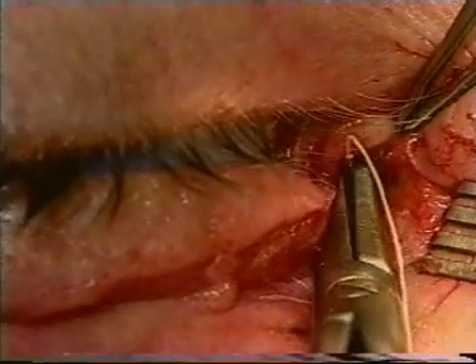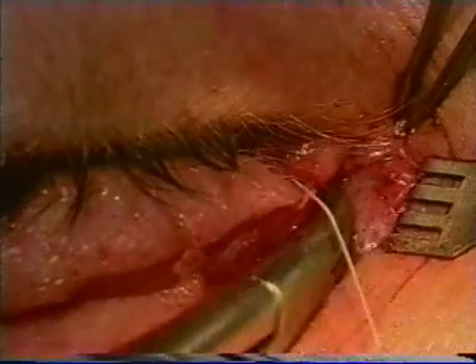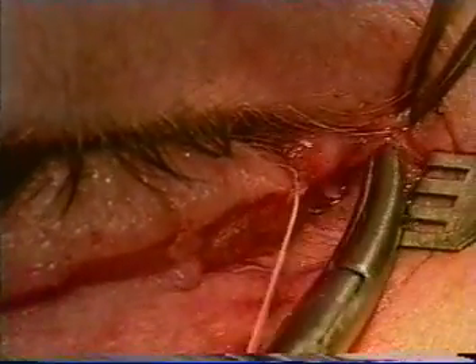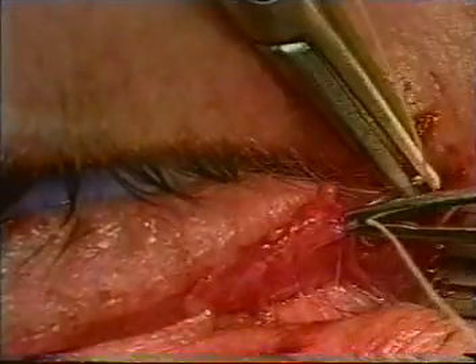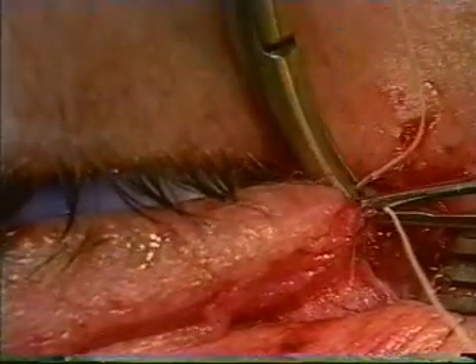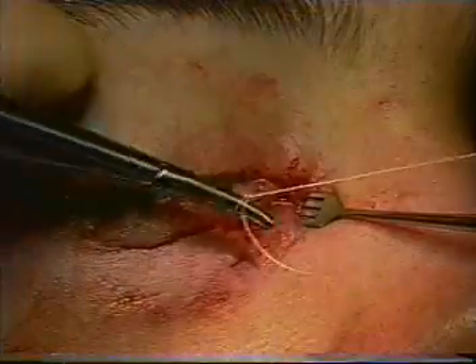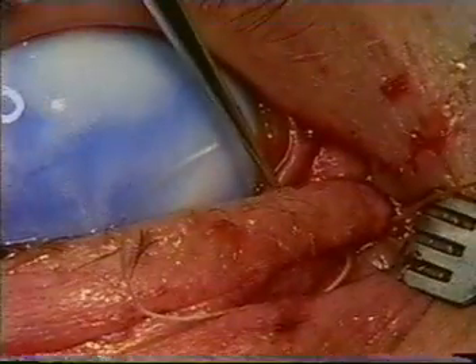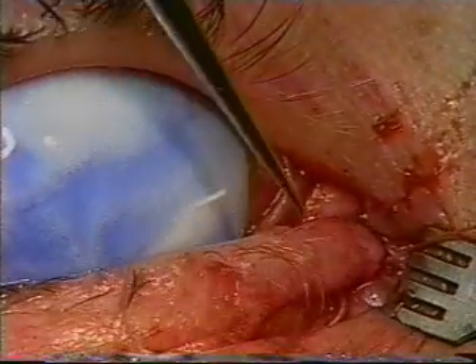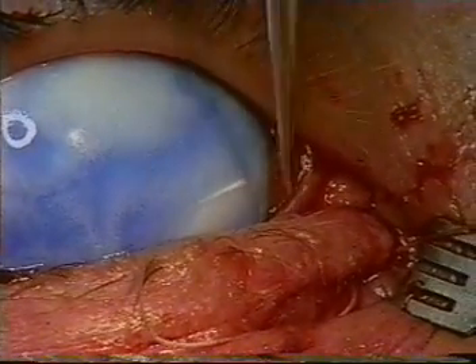Several 5-0 vicryl sutures on a P2 needle are passed through the medial canthal tendon area to reattach the cut end of the lid. We try to place one above the cut canaliculus and one below. The position of the plug is checked to make certain that it is within the lacrimal lake.